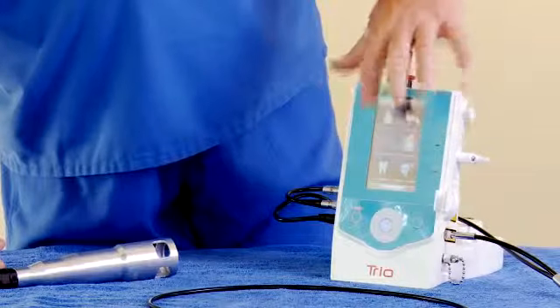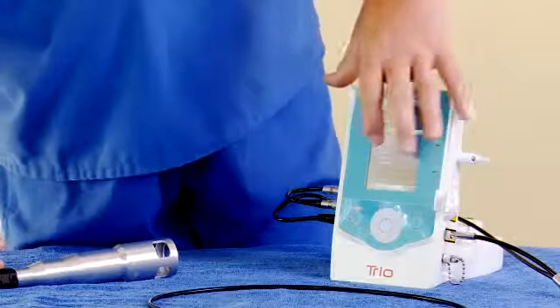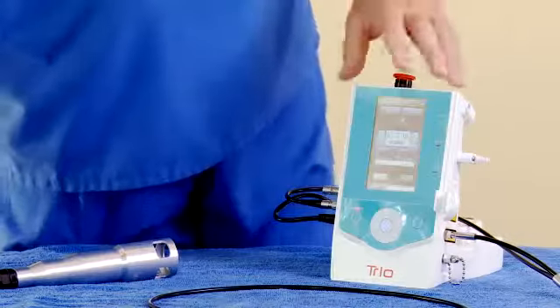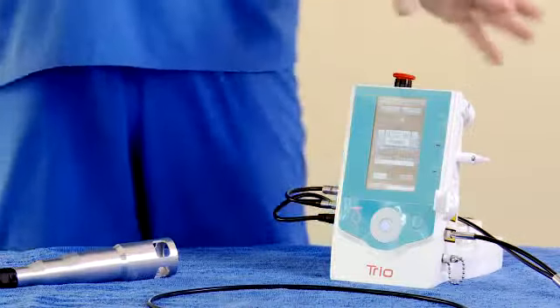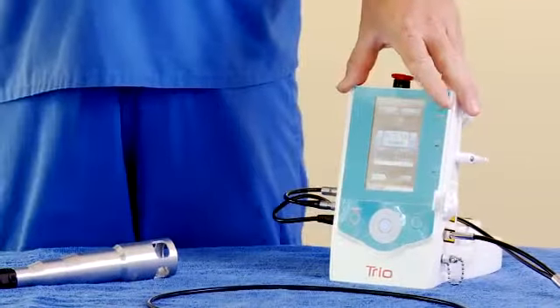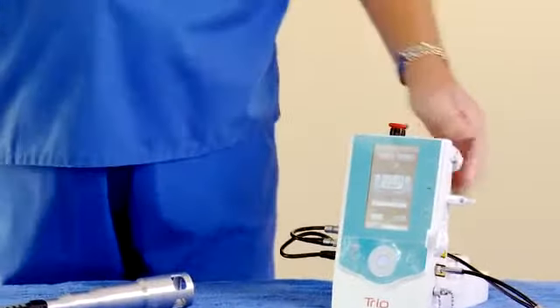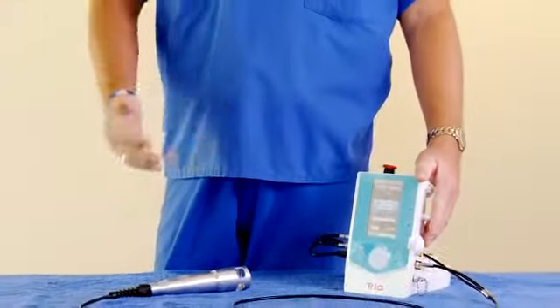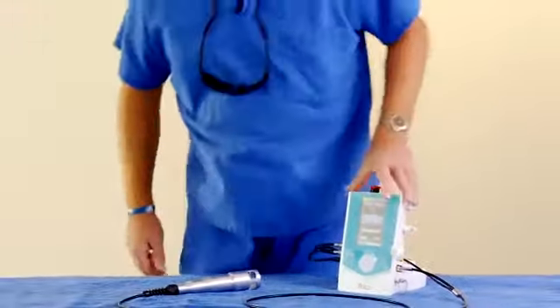Again, like we talked about, if we go to equine and go back and hit enter, typical is 8.5 watts. That's for about a 1,100 pound horse. And the felines are for about a 10-pound cat. So you have to use your clinical judgment to decide if you want to turn the wattage up or down depending on what you're treating.